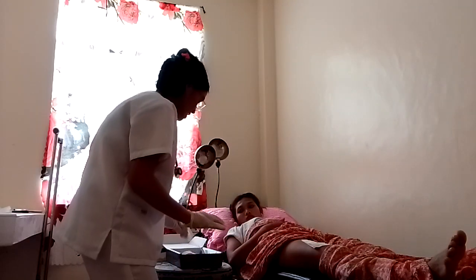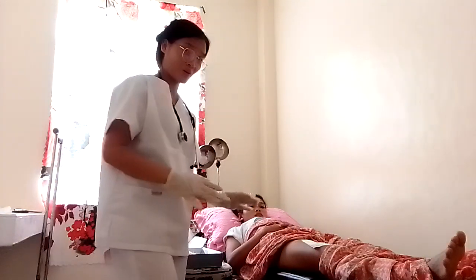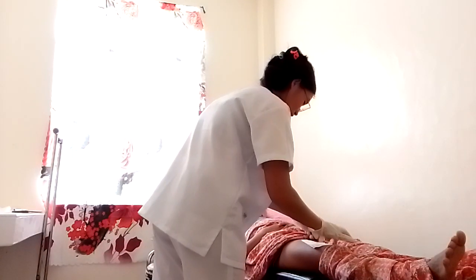And then after that one, as I said earlier, with glove hand, carefully remove gauze dressing. So we remove the gauze dressing, taking care not to dislodge drains or tubes. We should not pull the patient's wound too hard. Then, keep soiled undersurface away from client's sight. Okay? So we remove it. Okay, ma'am? Okay, so after that, we have removed the gauze dressing.